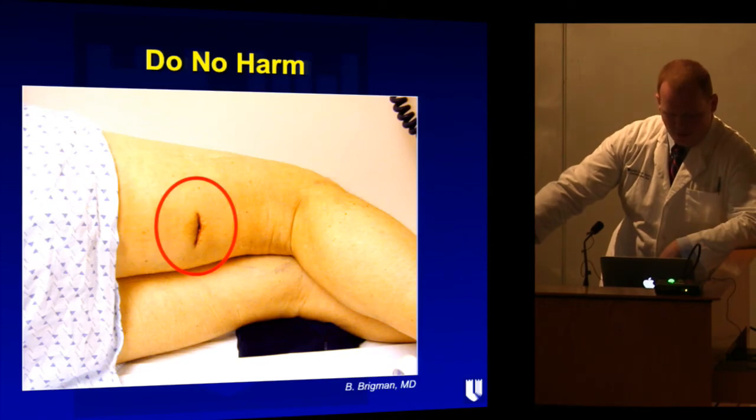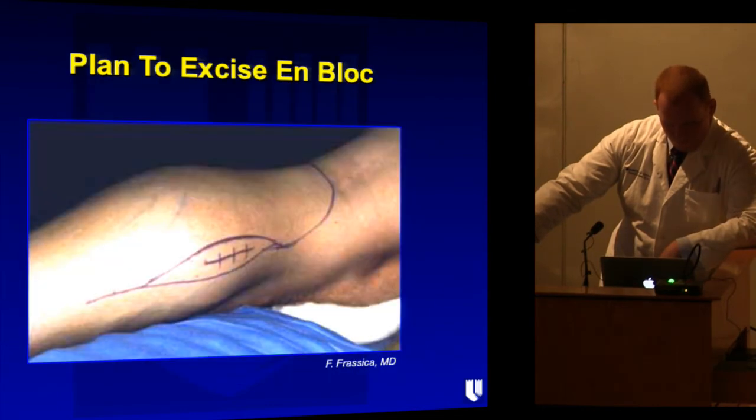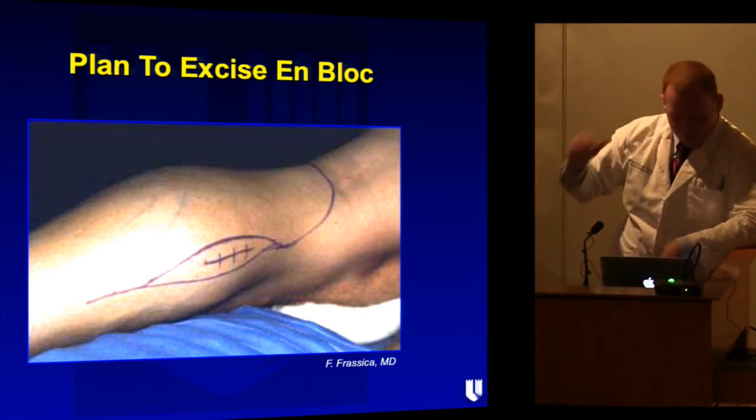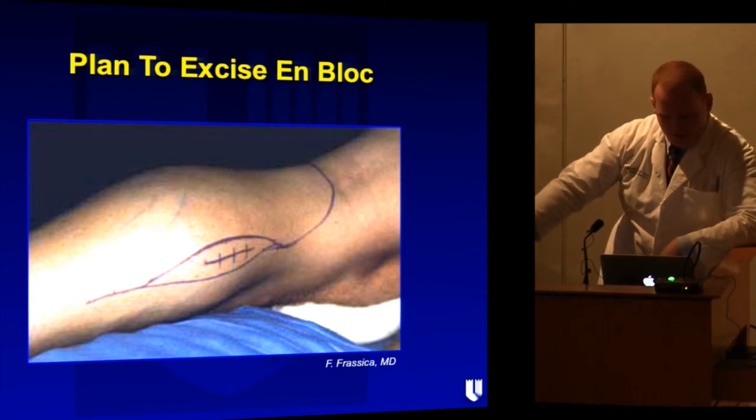Returning to our case report, we can see a relatively large transverse incision that has failed to heal several weeks after surgery. Here's a picture of an appropriate technique. The biopsy incision was made longitudinally, as we can see there, and now that the patient has returned to the OR for excision of the tumor, the biopsy incision has been remarked with plans to remove the previous scar en bloc during the second procedure.